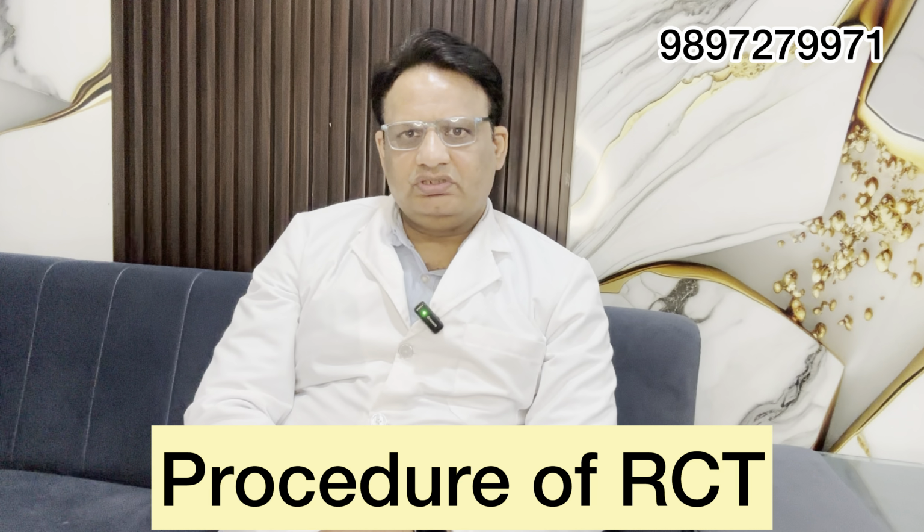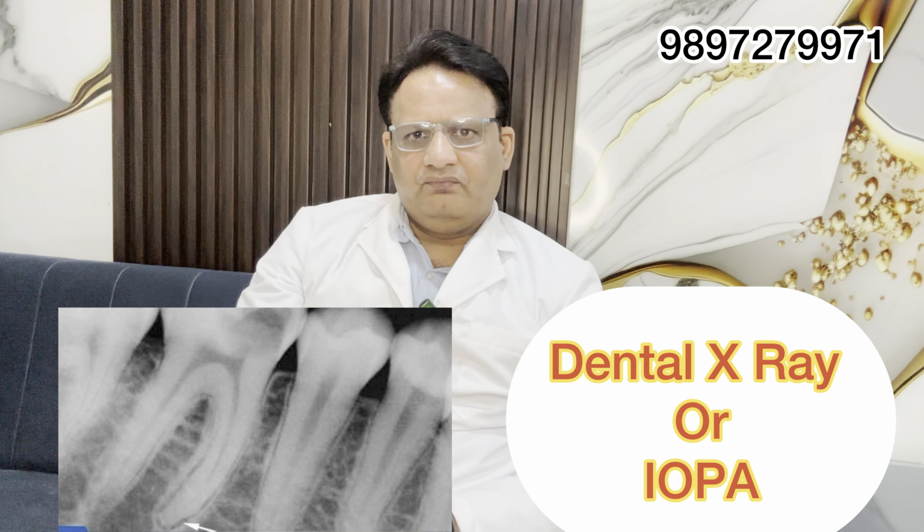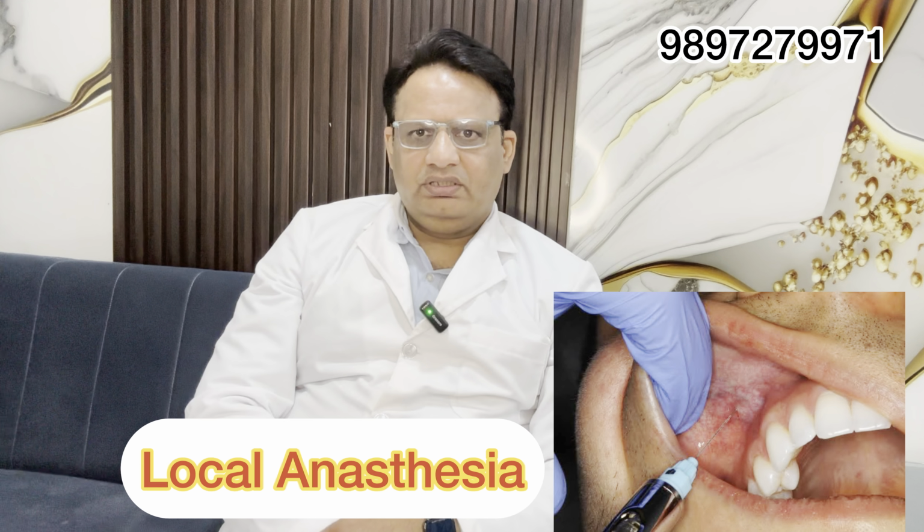Now comes the procedure of the RCT. In this procedure, we will go for the X-ray. Then we'll check whether the cavity reaches the pulp or not. If the cavity reaches the pulp, then definitely we have to go for the RCT. And before starting the RCT, we have to give the LA, that is local anesthesia, in the tooth in which we are starting the RCT.